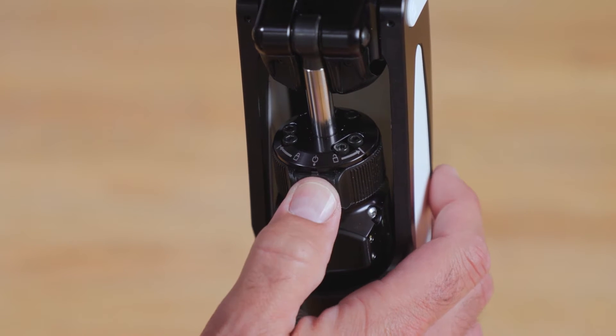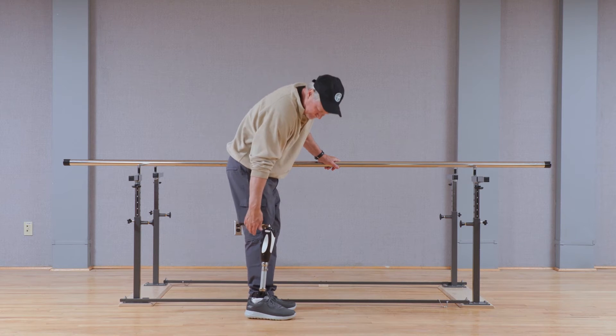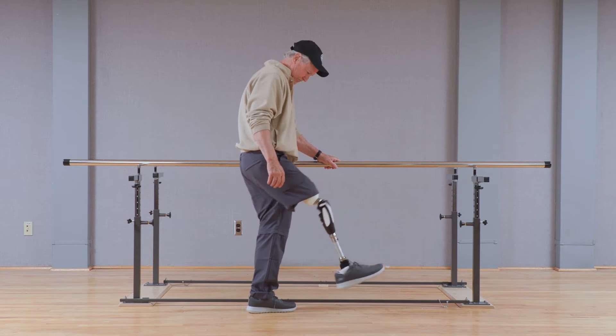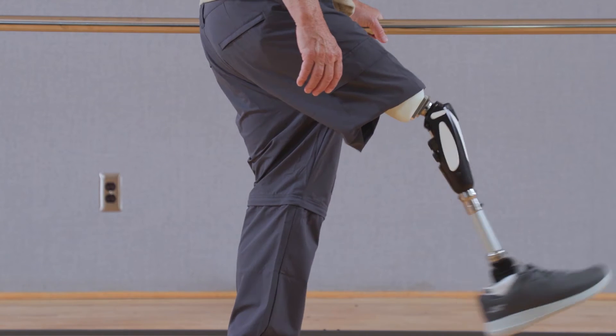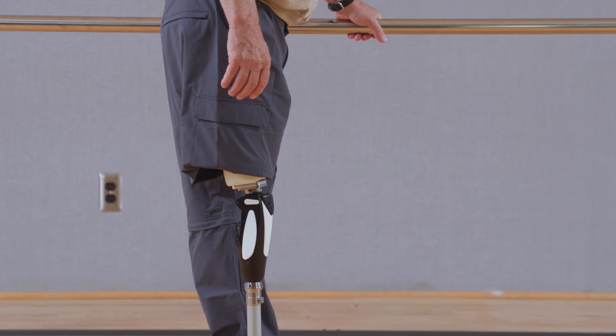Toggling the mode selector switch to the right bypasses the hydraulic resistance in the knee and enters into free swing mode, with low resistance to flexion and extension. This can be used for cycling and other activities where low resistance is desired. It is important to note that extreme care should be taken when ambulating in free swing mode, as the knee will not provide resistance to flexion and this could cause instability in gait due to unexpected flexion of the knee.